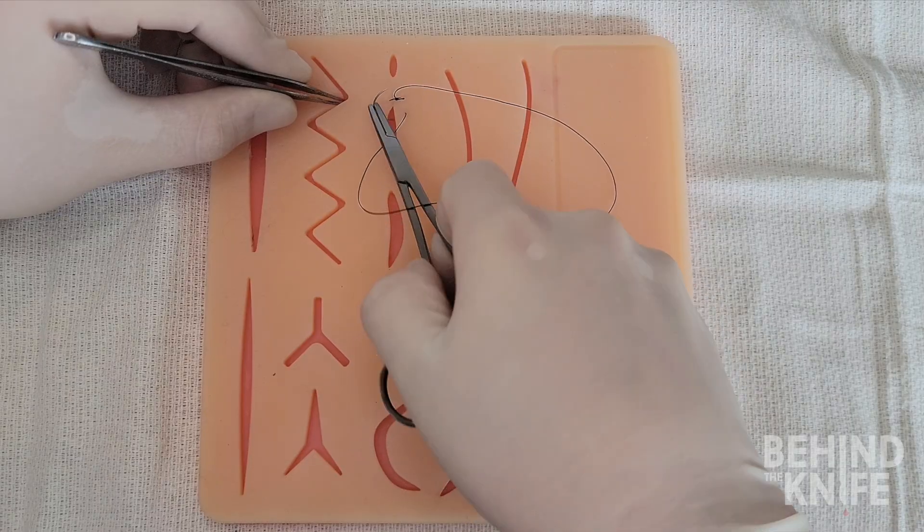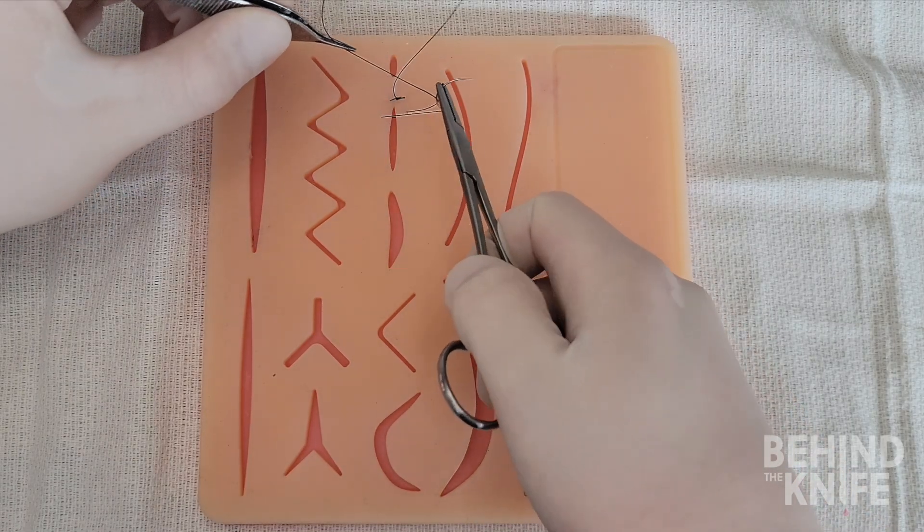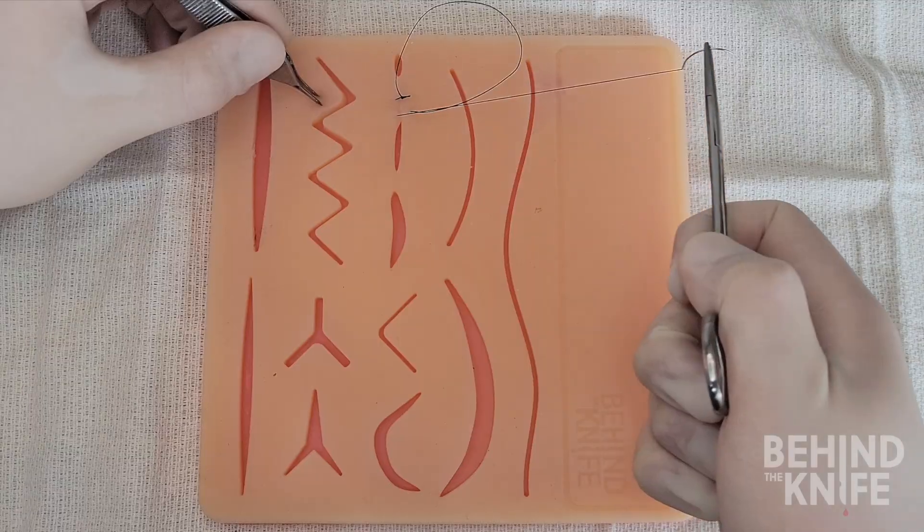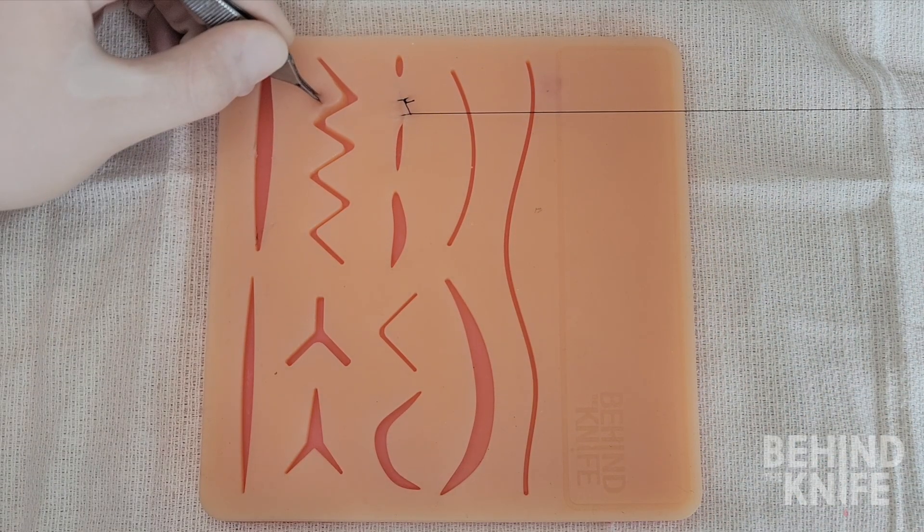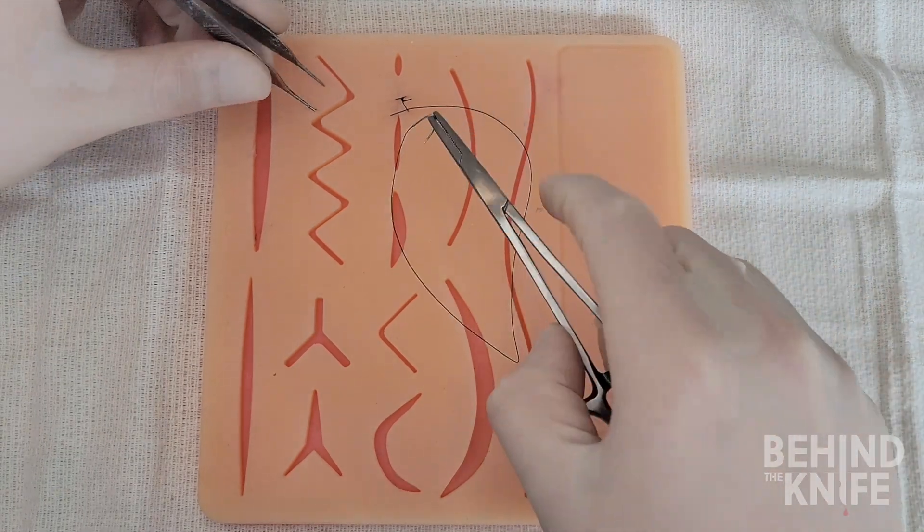After you grasp the needle you will then pull laterally which will lead to the suture not only running across the wound but also running down parallel to the incision. What this does is lock each loop of suture in place.